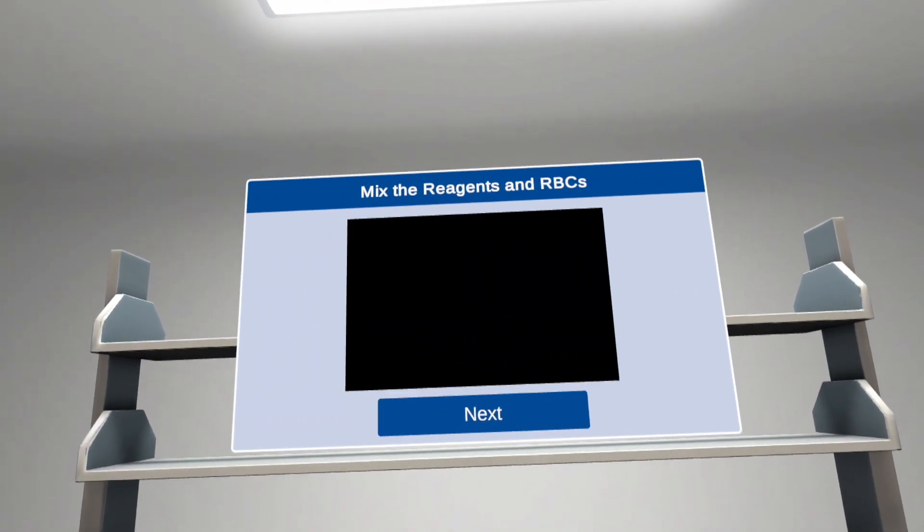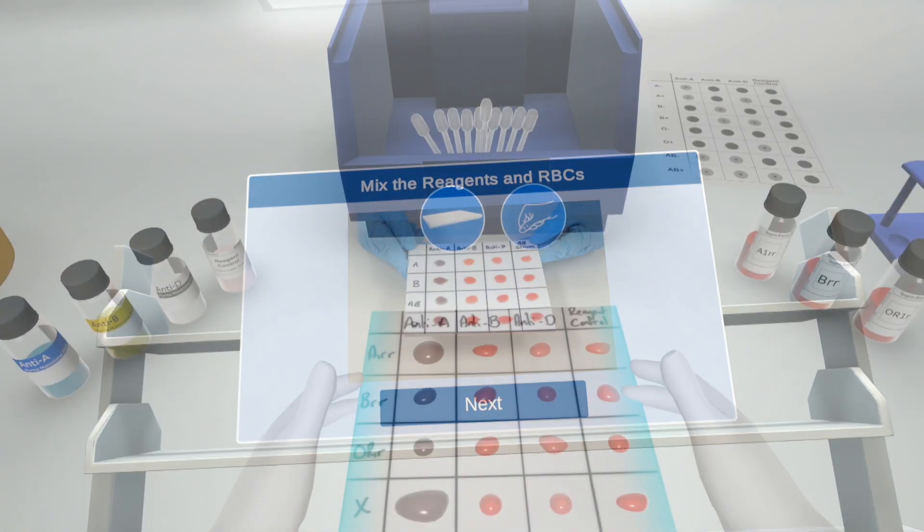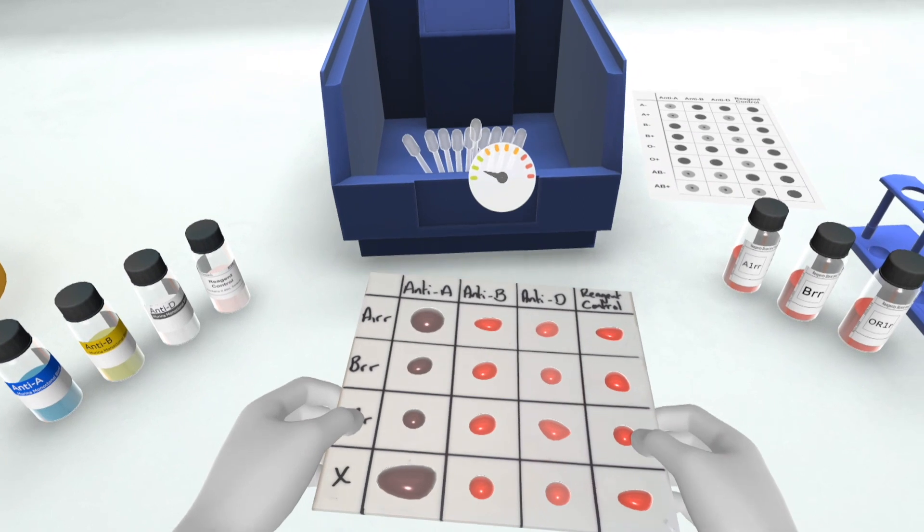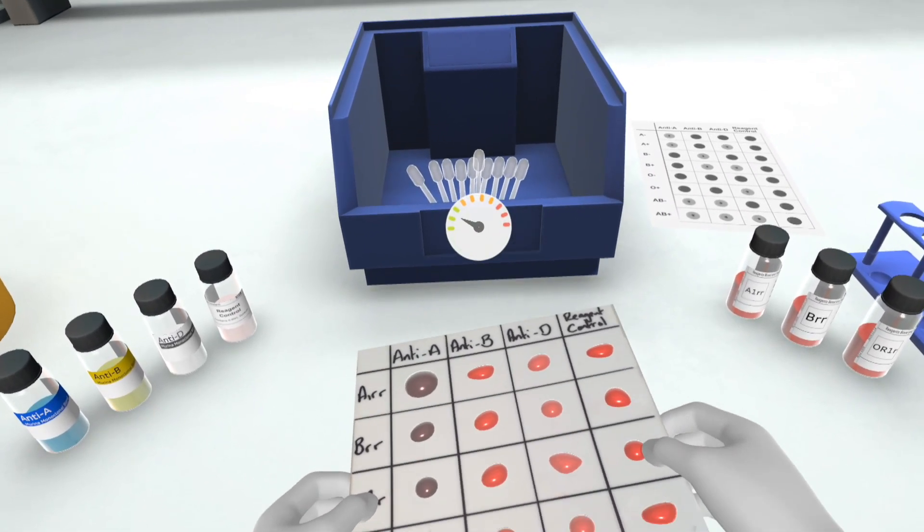Look up. It's now time to mix the reagents and RBCs as seen in this footage. Don't knock too vigorously or you might risk the drops running into each other. Look at the gauge and keep it in the green zone as before.